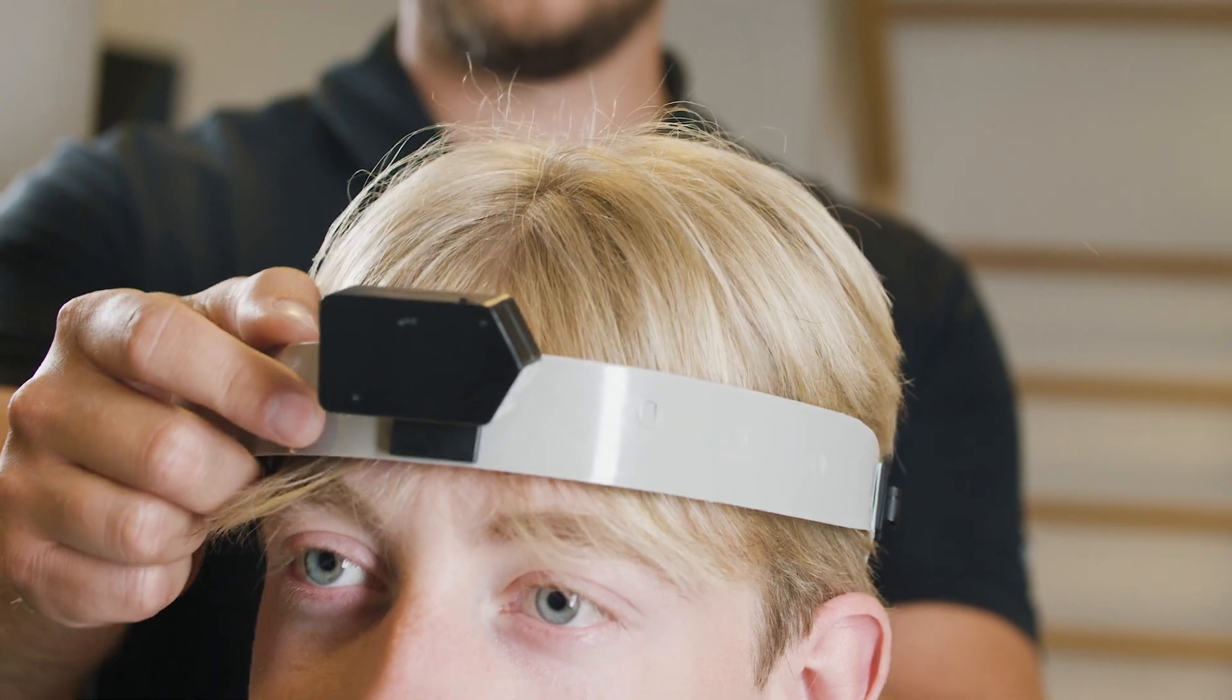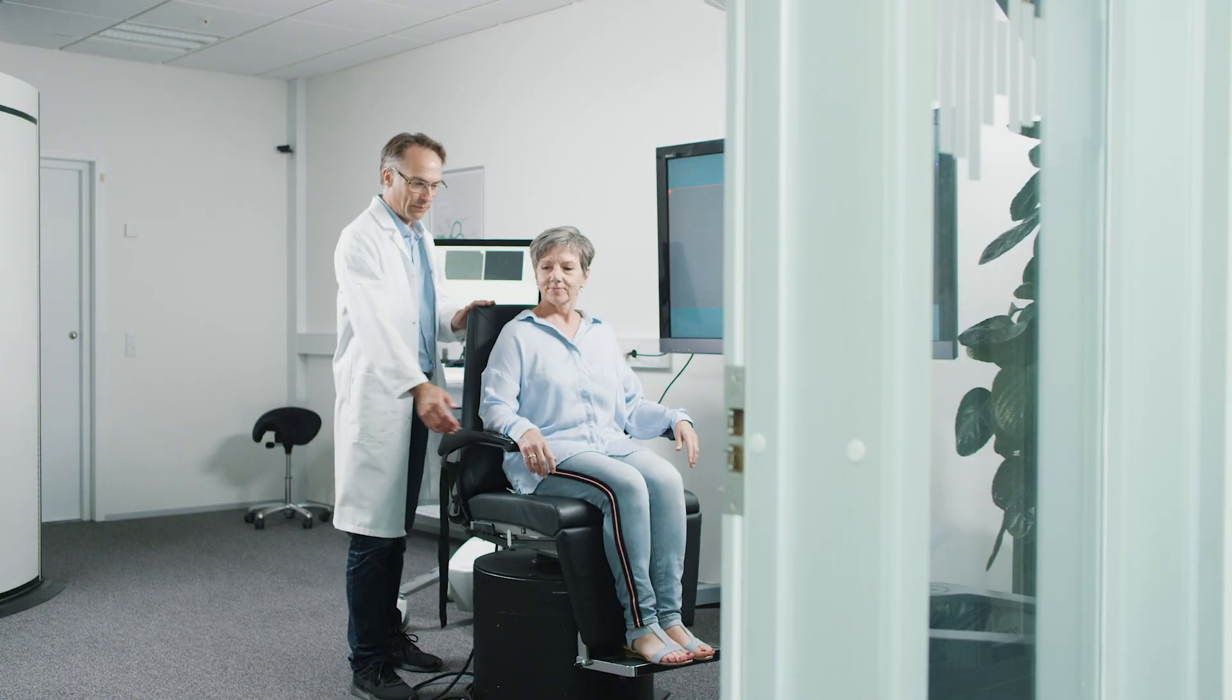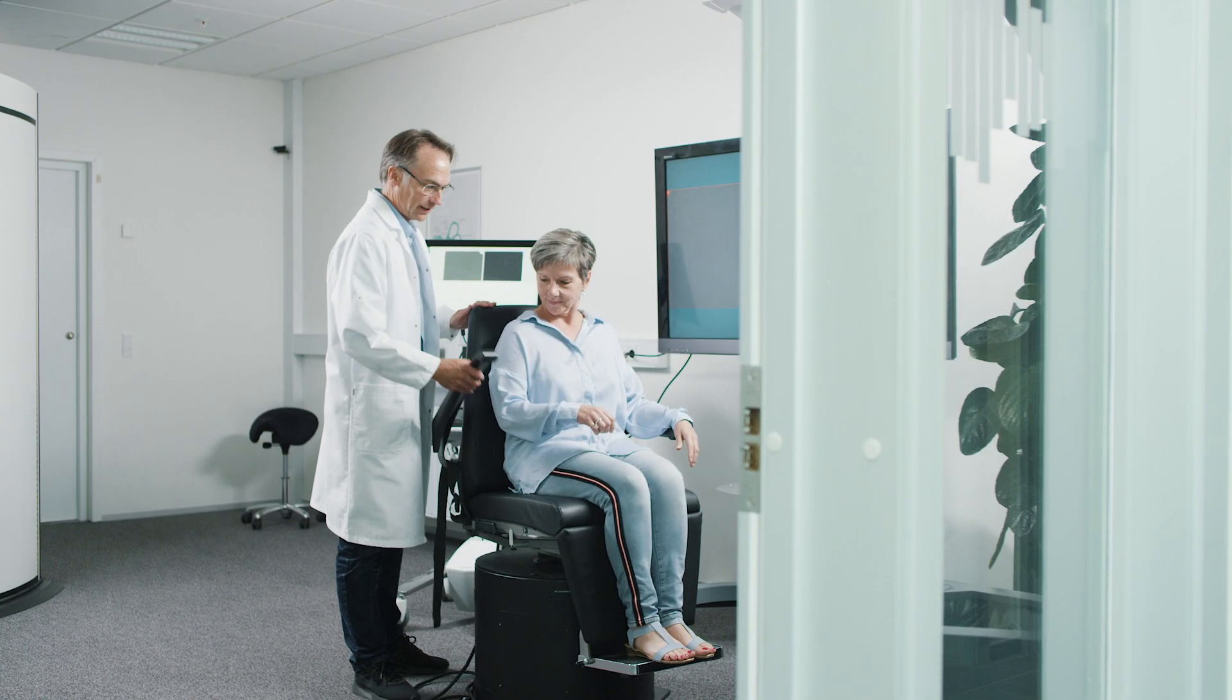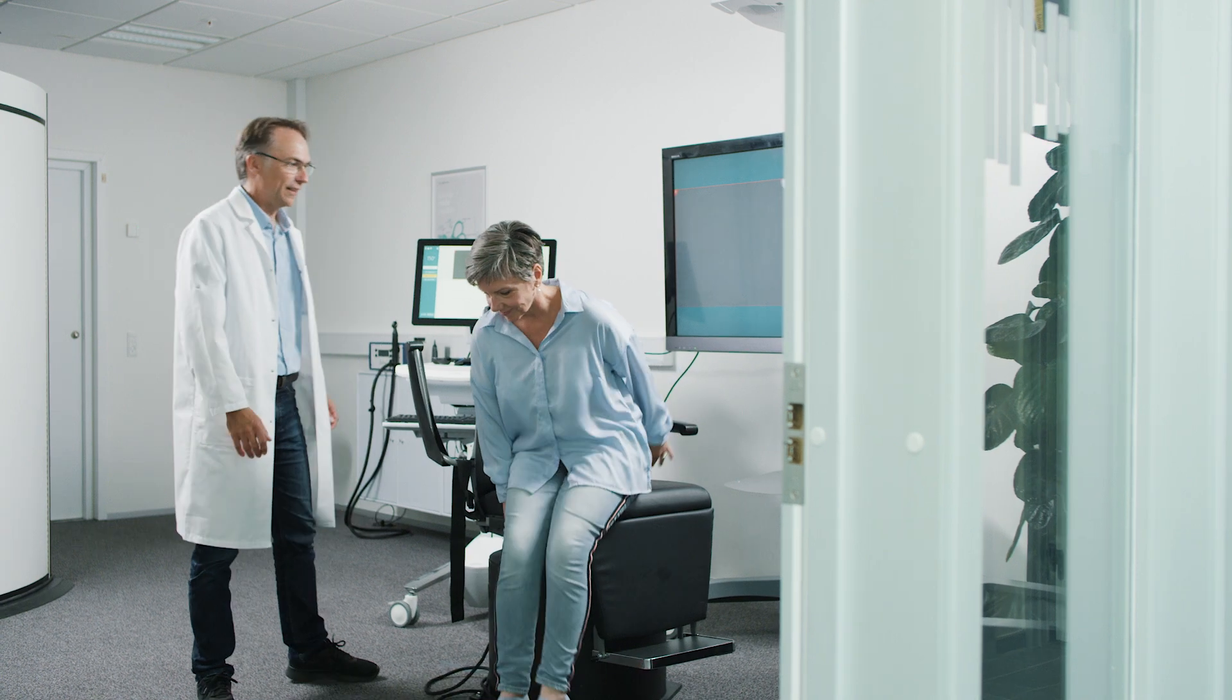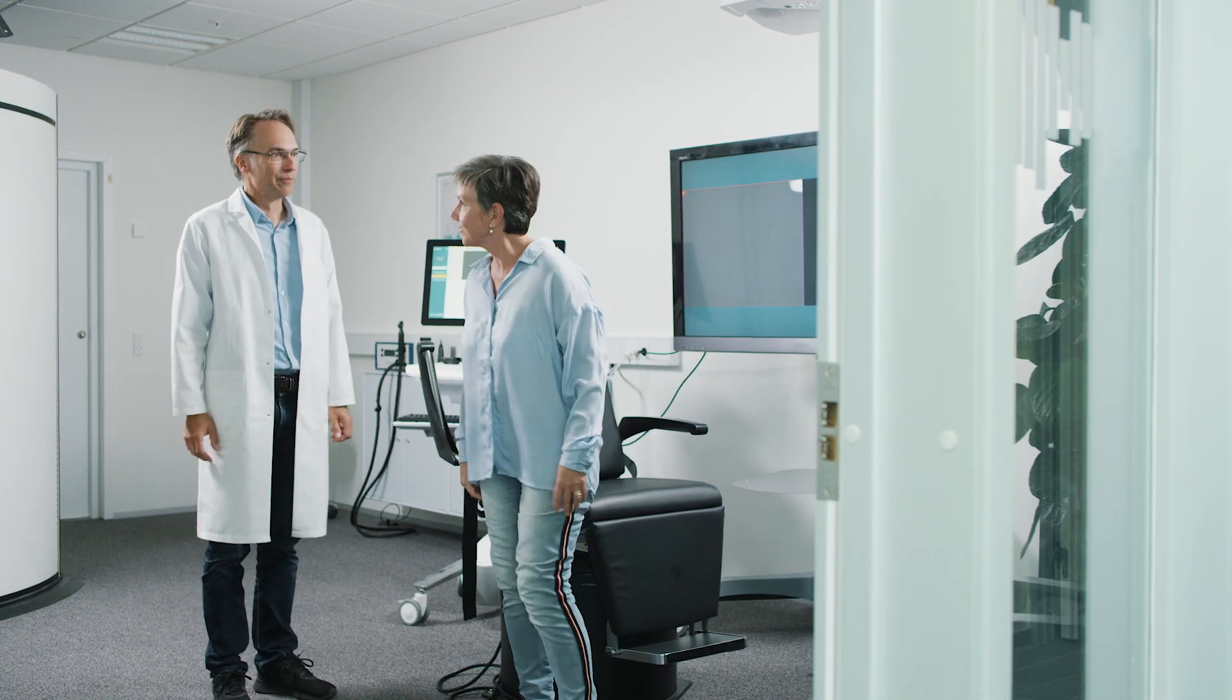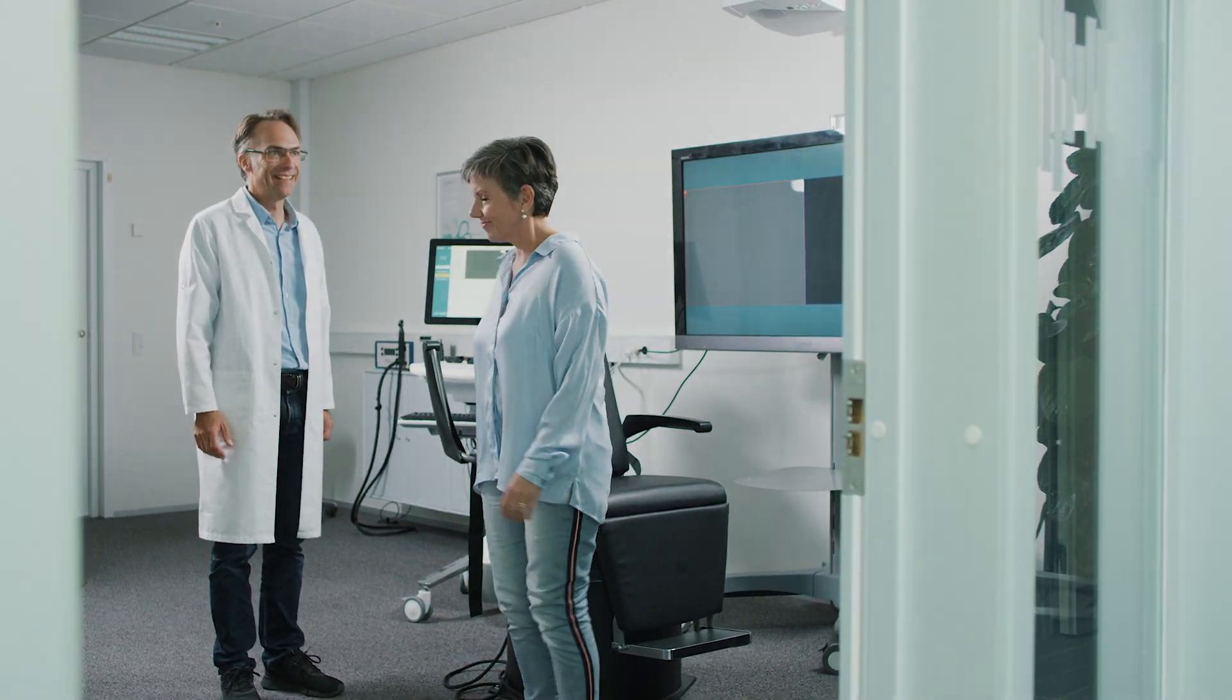We say it is vestibular testing made visionary. Visit us now at interacoustics.com to learn more about Visualize.